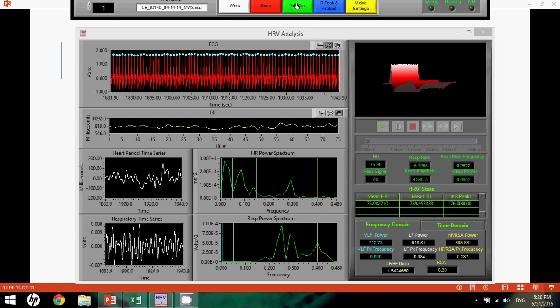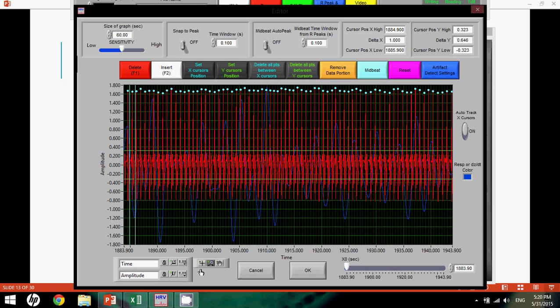I'm going to go out and come back into that window, and we're going to take a look at some zooming features down here at the bottom. So first off, this is a marking tool. You can see here that you can mark and delete points with this particular function, and it shows up as a cross, and that's typically what I refer to it as.